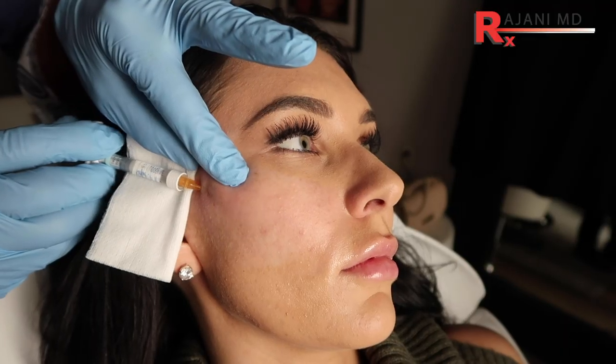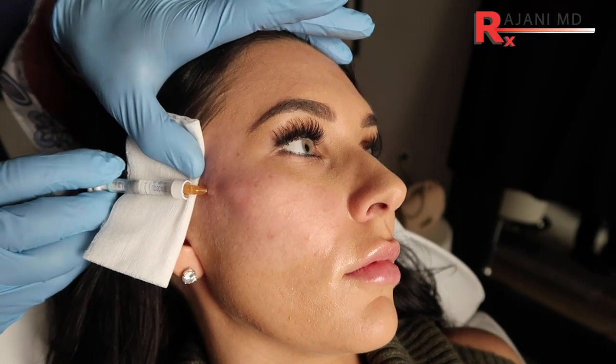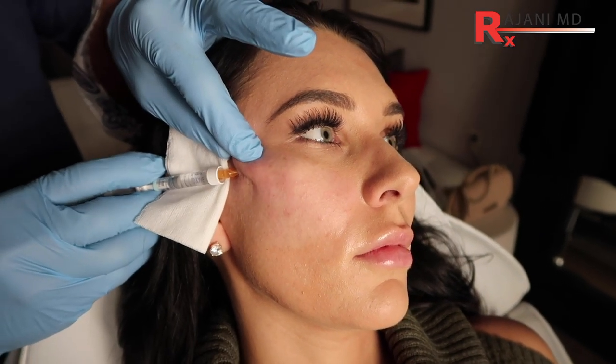With a cannula, sometimes to create beauty you'll be at an angle that's above the zygoma superiorly to create that beautiful angle, particularly for a model-like look. However, with the cannula I'm more comfortable because I can be in the subcutaneous tissue, hit the bone, and then slide down. If using a needle, that middle vessel is particularly one to avoid.